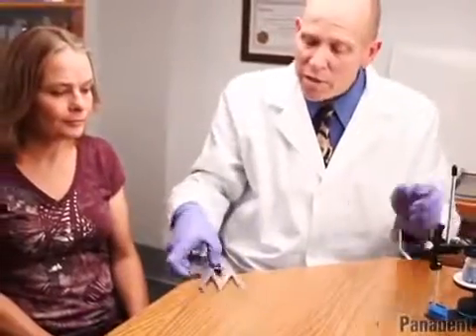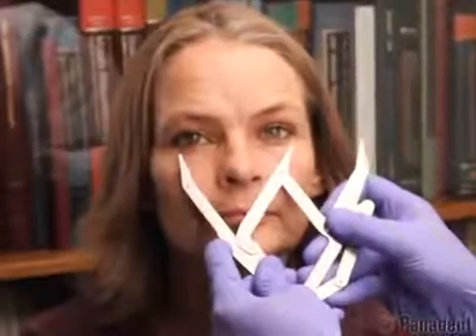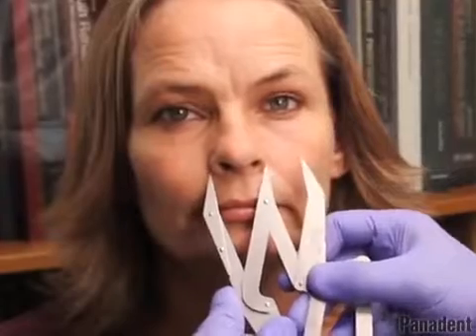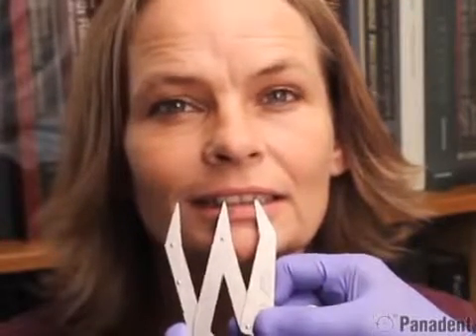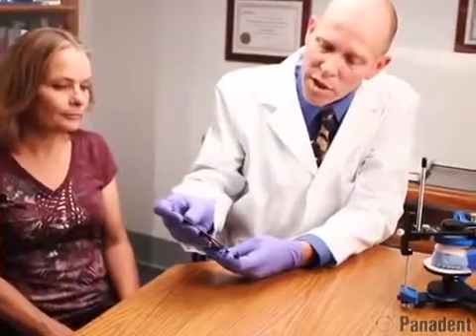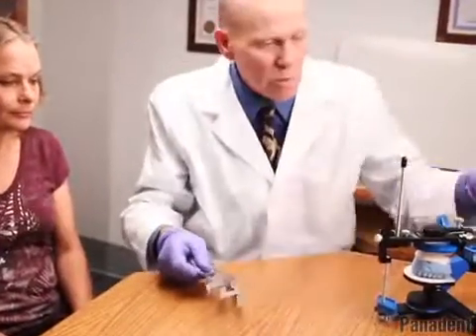We can also evaluate lateral proportions of the face. If we measure the lateral canthus of the eyes, it is about 60% wider than someone's mouth. Then if we re-index the width of the mouth, it will be approximately 60% wider than someone's nose. Then we reevaluate the width of the nose, which will then give us the width of 2 central incisors. Once we have that, we can then measure that distance, which is 18 millimeters. We divide that by 2, which would be 9 millimeters.